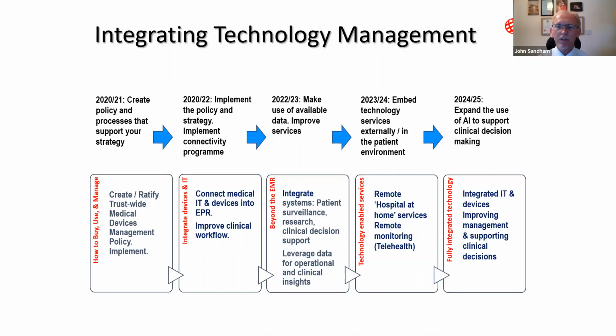The policy that you produce must be inclusive of all key stakeholders that will be on this 5-year journey. These will include the chief executive and board of directors, outlining responsibilities, and the directors responsible for medical devices, as outlined earlier in my presentation. I would envisage a 2-tier approach within the policy, with the exec team being on the top tier responsible for ensuring strategic vision within the policy, and a middle management tier responsible for the day-to-day operational compliance. The tier 2 stakeholders would include clinical or biomedical engineers, procurement, clinicians, nurses, IT, estates, etc.